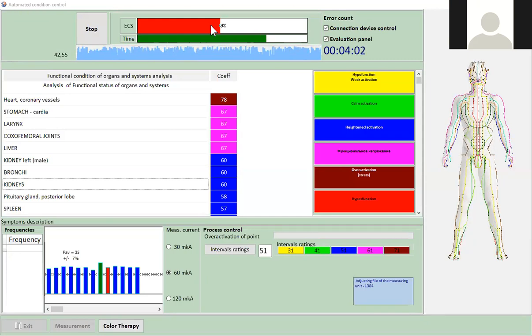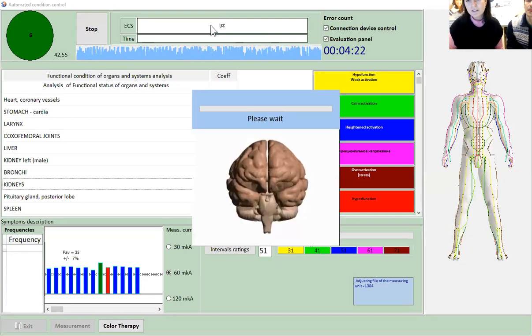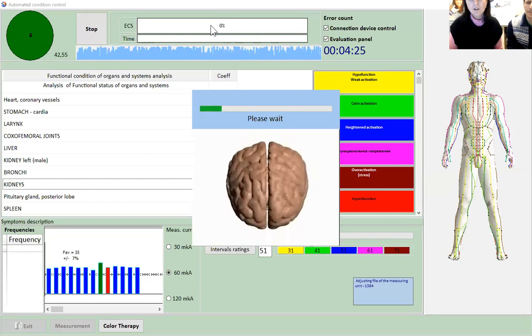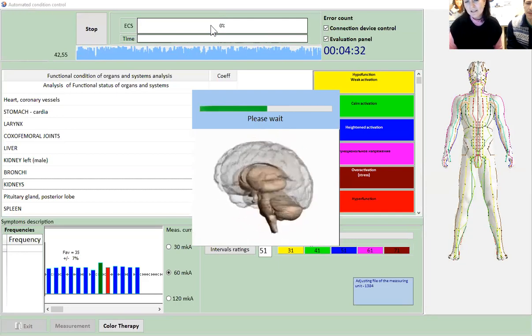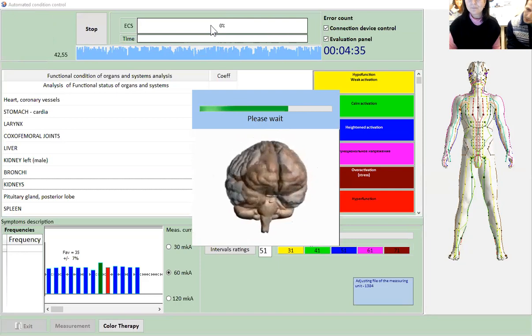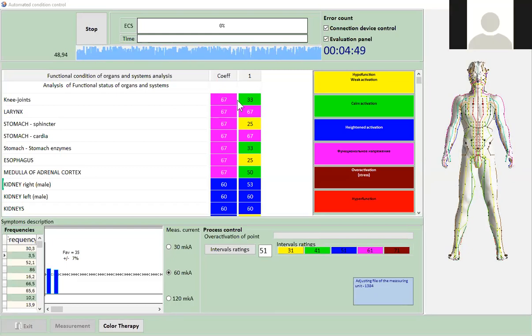Another question. I noticed in the instructions that it said you shouldn't have anything to eat for 2 hours before you do this. How crucial is that? It is not too crucial. If somebody was eating, you just have to ask what and when, because it can overstimulate some points of the body. It will obviously show the stomach or intestine as more tense. See, here comes another stage, a second measurement. It always shows the highest points.